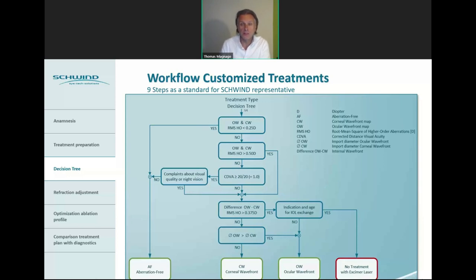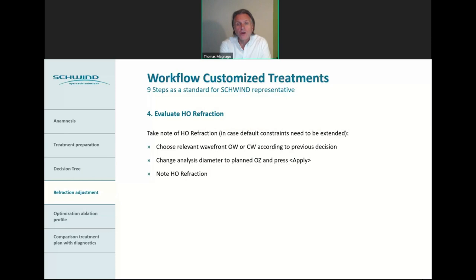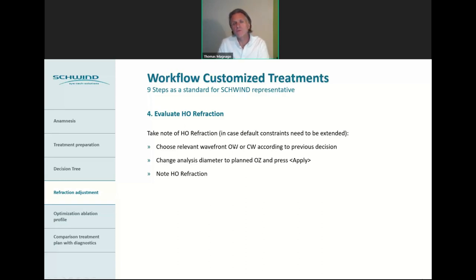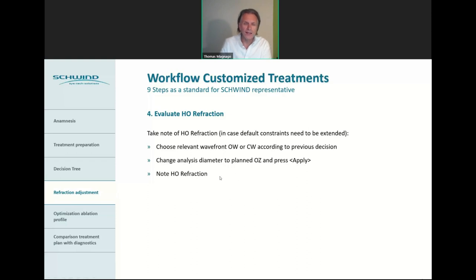This is the decision tree we typically use, and which you also find as a Schwind user on the background of your panel PC as reference information. The next step is what we call evaluation of the higher-order refraction. The higher-order aberrations have an influence on the subjective refraction. With the ORK-CAM software, you can calculate the higher-order refraction. Note down that higher-order refraction, and choose it from the relevant ocular or corneal wavefront according to the decision tree. Make sure you change the analysis diameter to the planned optical zone, then press apply and note down the higher-order refraction.